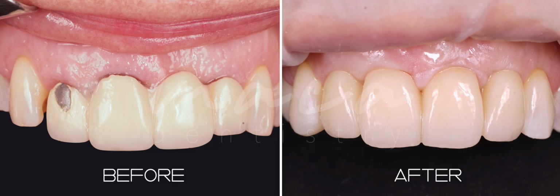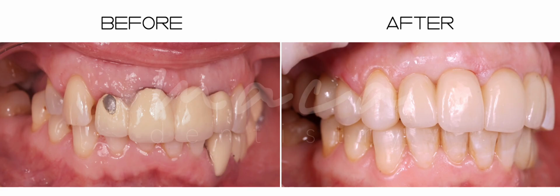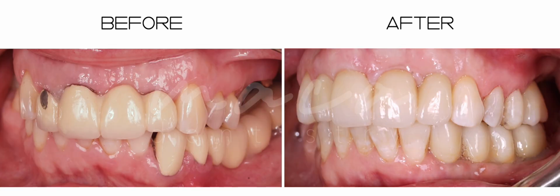And now some before and after pictures. First, a close-up of the anterior zone. Here, a lateral view of right side. Lateral view of the left side, and here note the big difference on the bite and also on the soft tissues around the restorations of the third quadrant.